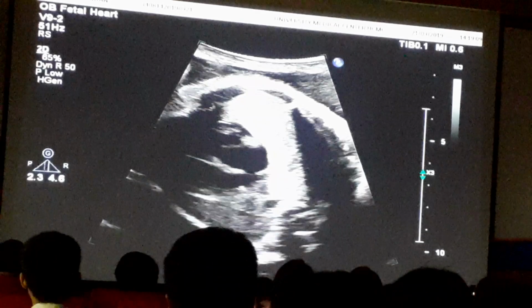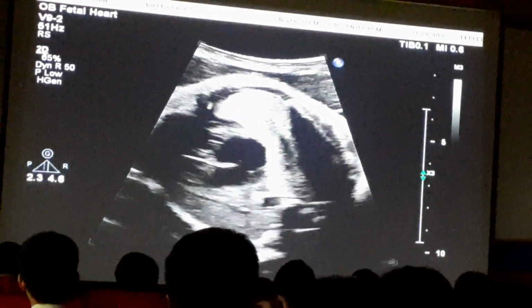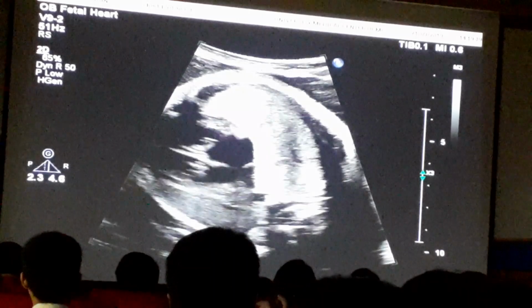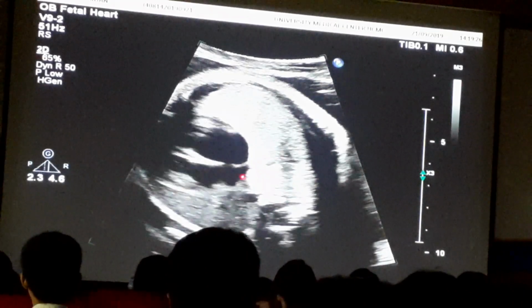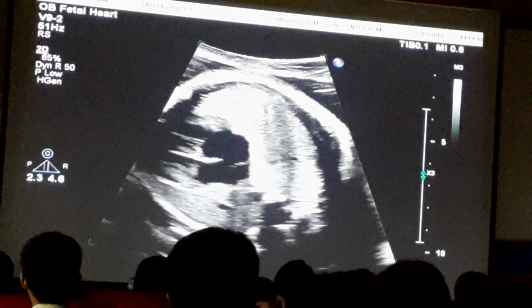Mình thấy có vấn đề gì đây? This looks like a microcystic type. Yeah. Because it's just hyperechogenic. Mình thấy ở đây cái dạng tăng sinh dạng nang tuyến nhưng mà cái dạng tuyến nhỏ, cho nên ở đây mình thấy nó đều vậy.